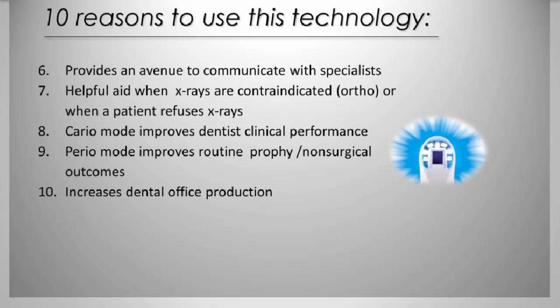Also, again, I think I alluded to this, it's a helpful aid for when x-rays are contraindicated or when a patient refuses x-rays. The caries mode improves the dentist's clinical performance. What I'm talking about there is those photos. We go all the way back to the slides where it actually showed the dentist prepping along the way and using the camera to actually see if there was decay still left.